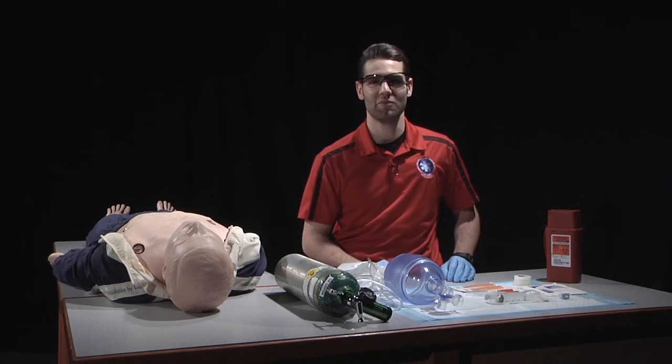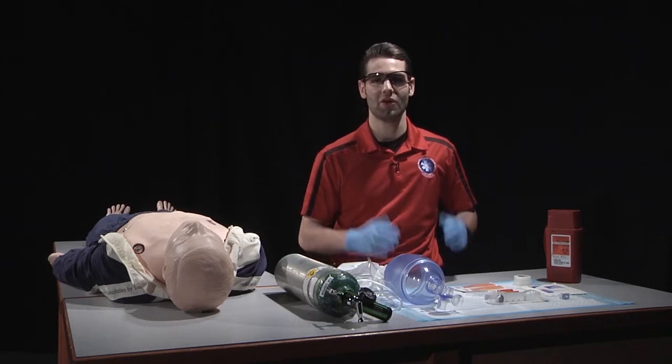Additional ventilation equipment for this skill may include a jet ventilator if available. The recommended PPE for this skill are gloves and eye protection.